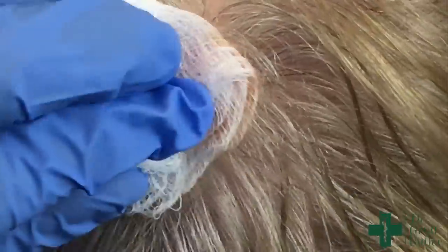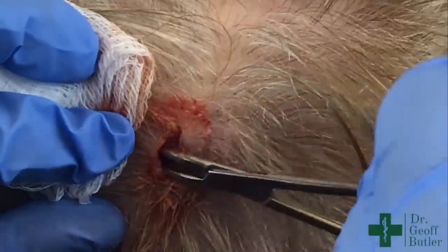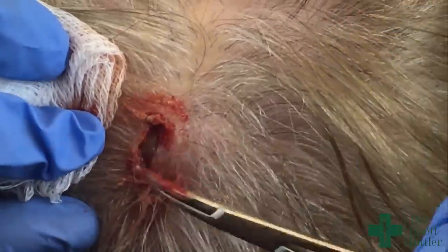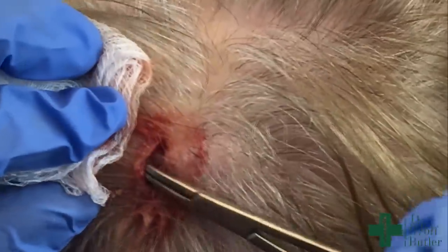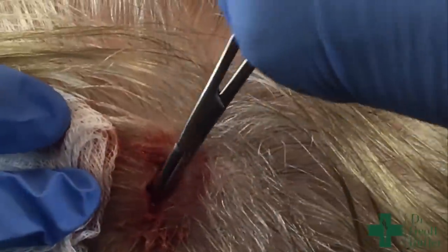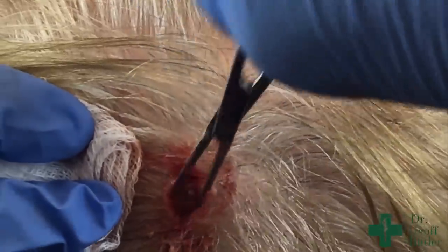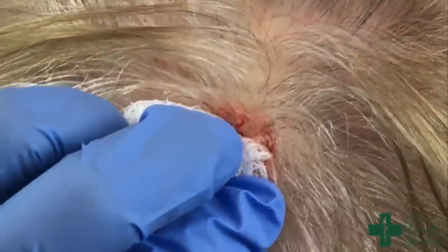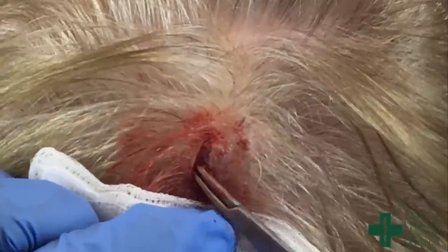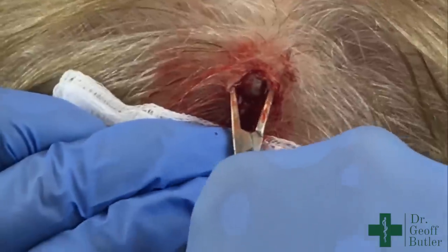Does that hurt? I'm just going to add in a little extra anesthetic. Any pain on this side at all? Just in one spot — like the front part. Okay. This spot doesn't hurt at all? No. So the other thing you'll notice is scalp, regrettably, can ooze quite a bit — that's just the nature of it.